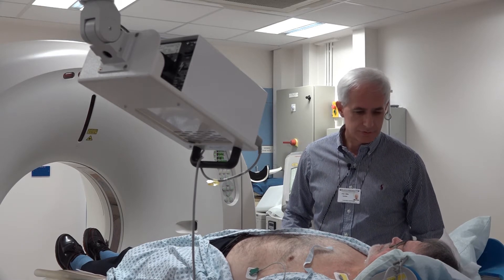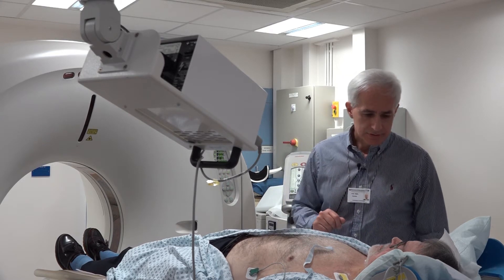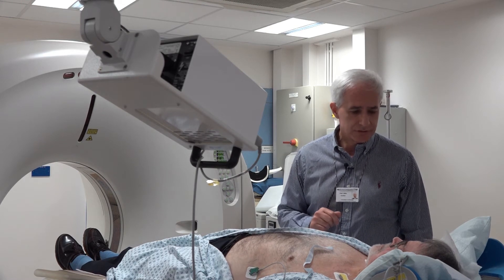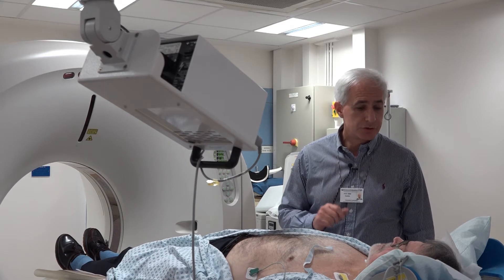A doctor will come and explain the details of the scan and to do some breath hold exercises with you. What you need to know about this test is it's a very safe, simple and easy test to do. It takes 10 minutes to complete, and for the 10-minute procedure time, we ask you to do two things for us.